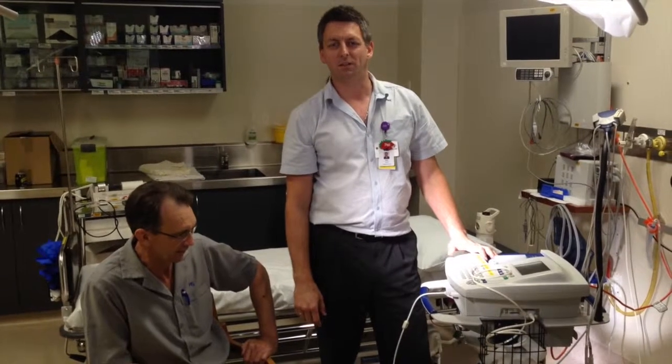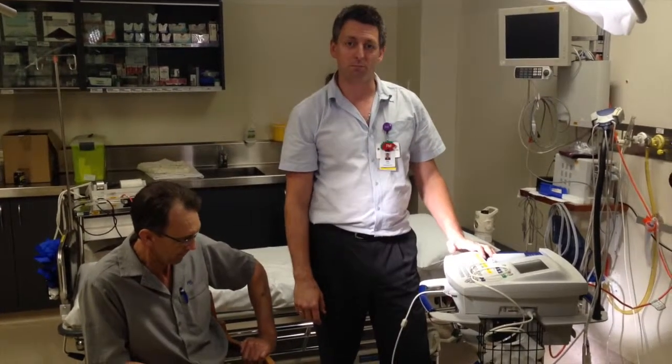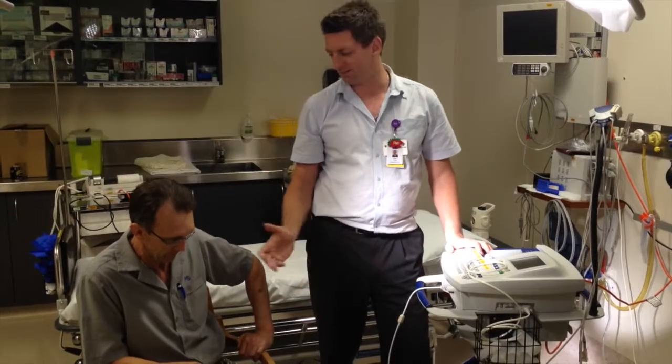Welcome to QtNOW videos. I'm going to show you how to use a spirometry machine today, and for that I have the lovely assistant Derek.